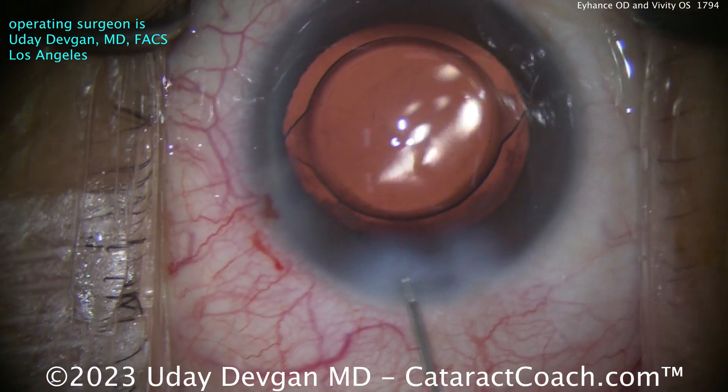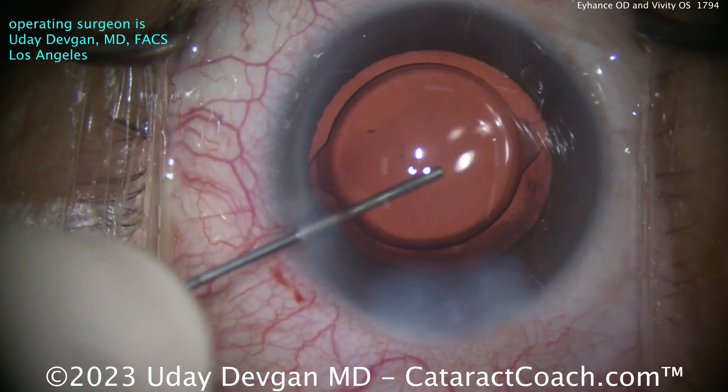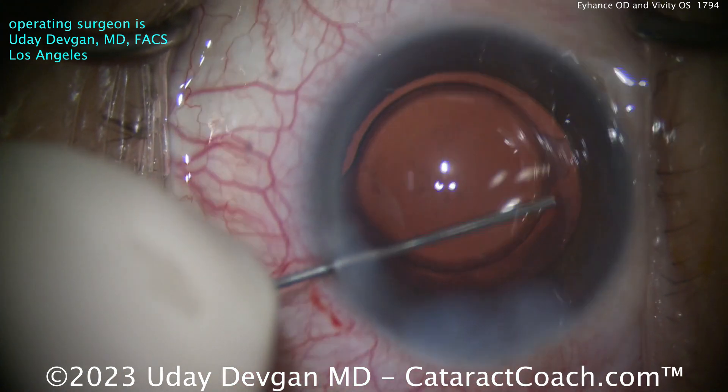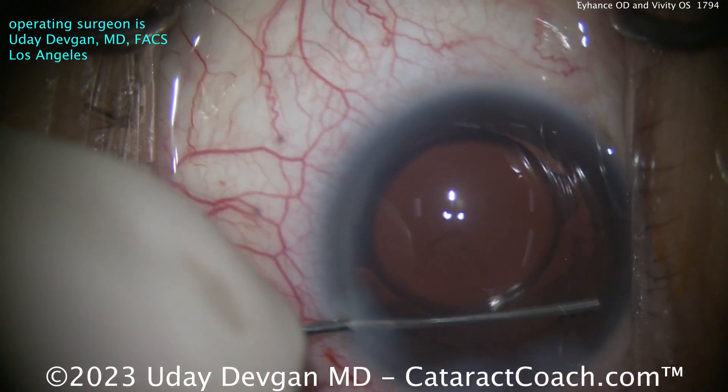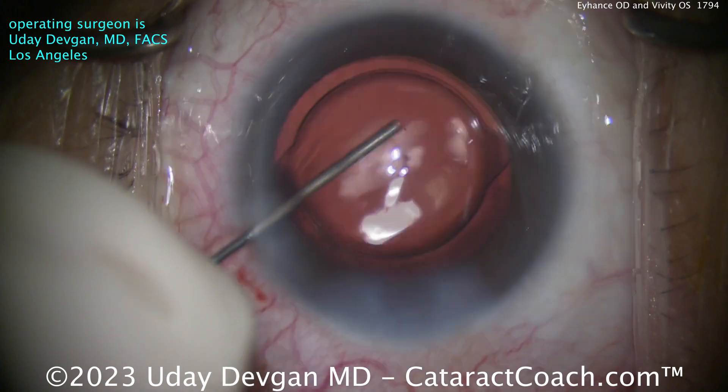Notice how we made that main incision really astigmatically neutral — 2.2 millimeters wide. Making sure there's no retained viscoelastic, clean that out real nicely. Beautiful result with the iHance in the dominant eye, set for best distance vision.